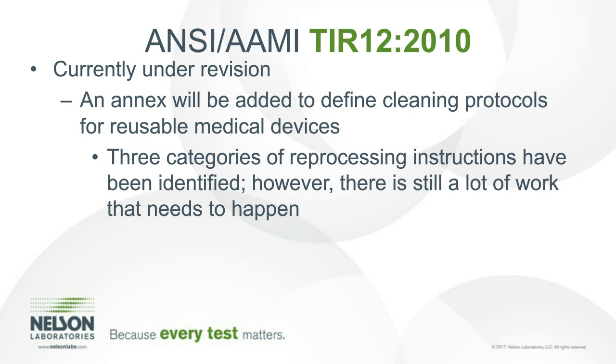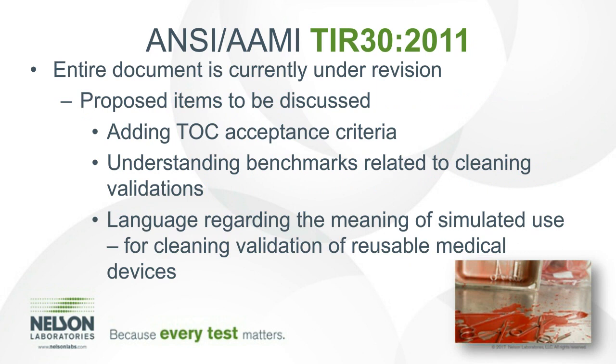As for TIR 30, which is test methods and acceptance criteria for cleaning reusable medical devices, is also under revision, and also a lot of work has been going into it. Some of the proposed items that will be discussed in the next upcoming meeting in October will be regarding TOC acceptance criteria, understanding benchmarks related to cleaning validations. Are we using the right benchmarks? Protein, hemoglobin, carbohydrates, TOC. What is the appropriate marker to use for testing?